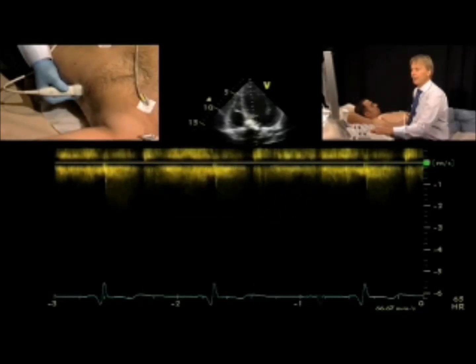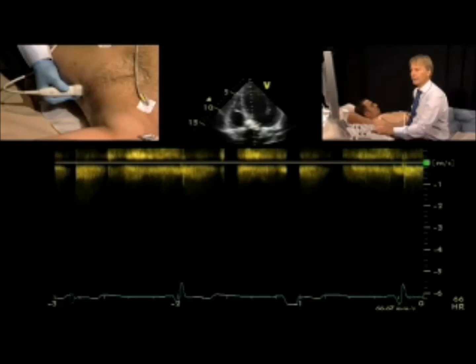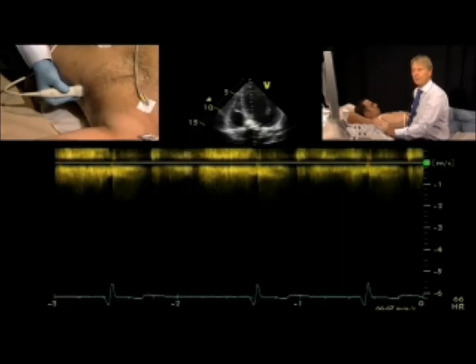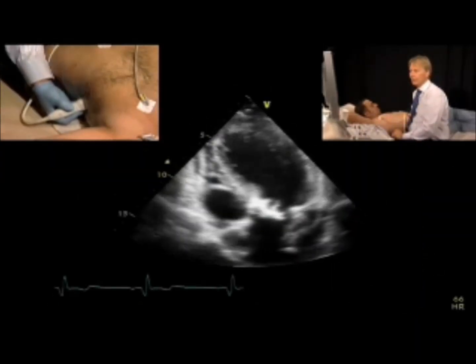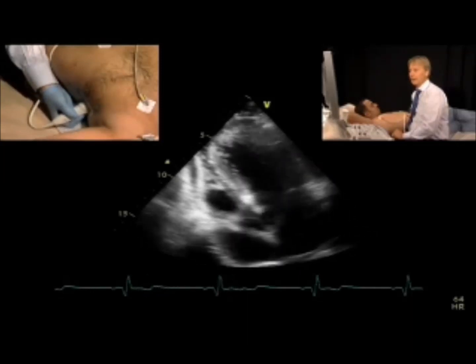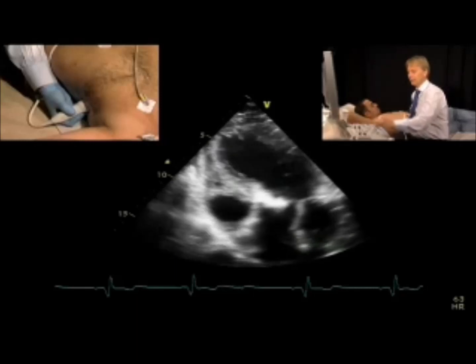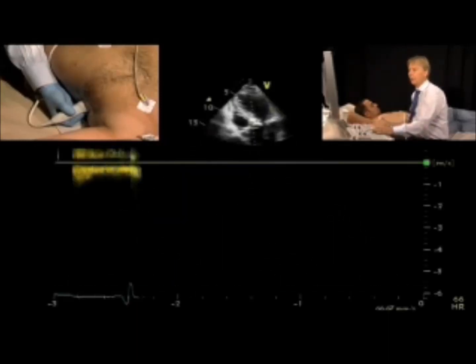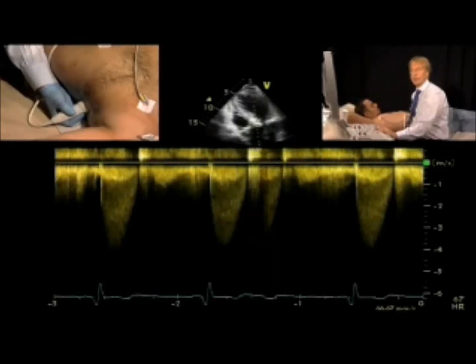It's very important to put the focus point exactly where the valve is. If the initial spectrum is not very good, optimize the signal by moving your transducer further lateral — this gives you a much better angle to the ultrasound beam so you are really parallel, and you will usually get much higher gradients than with the classical five-chamber view, as well as a much better spectrum.